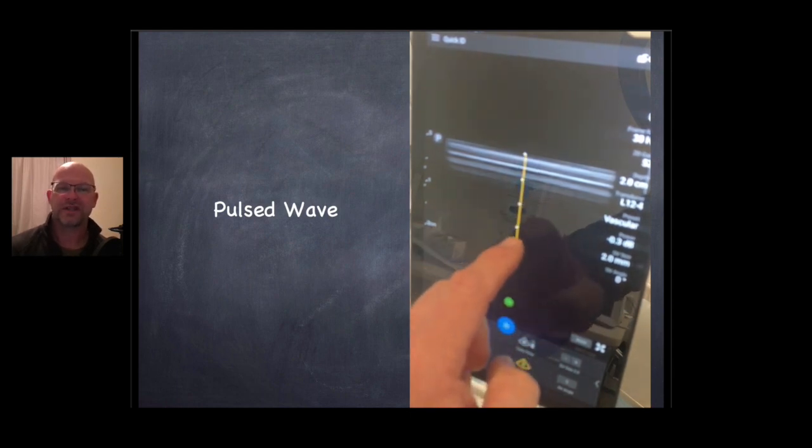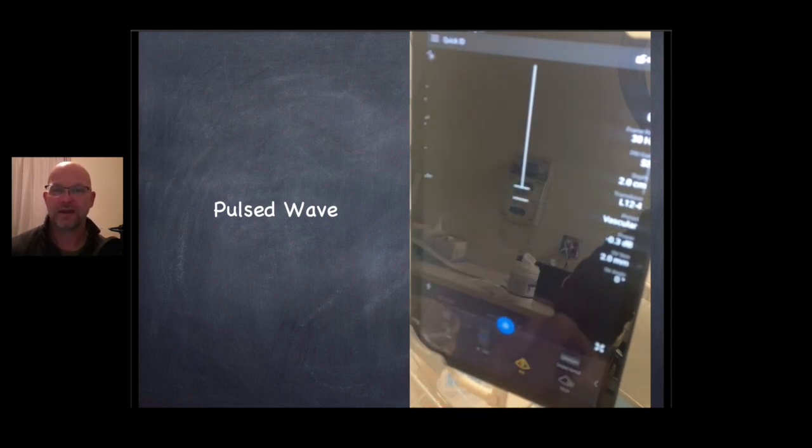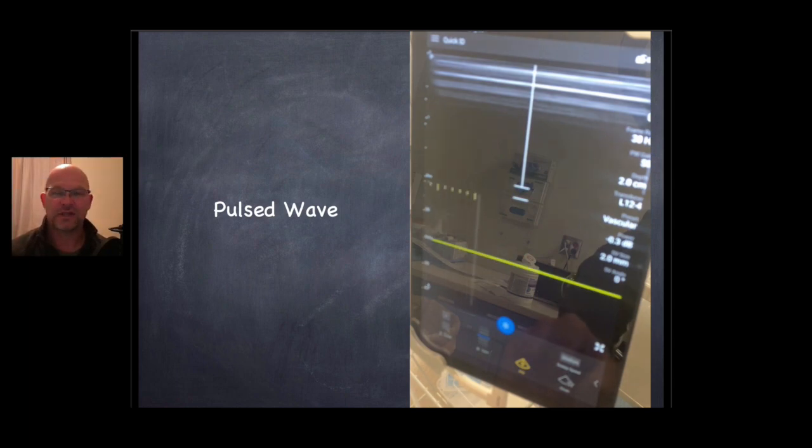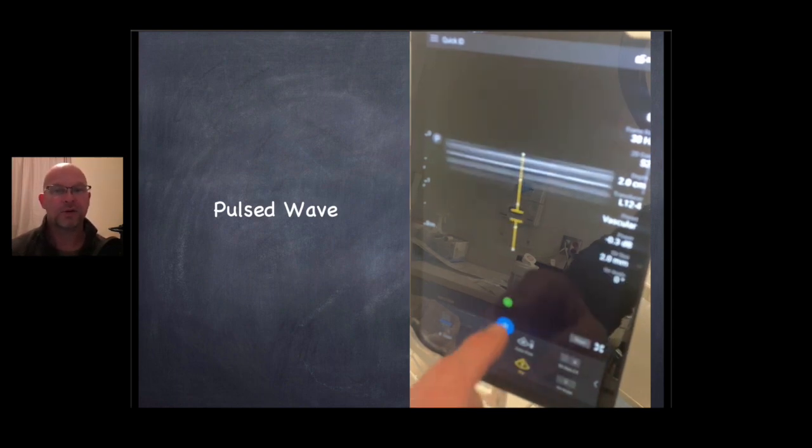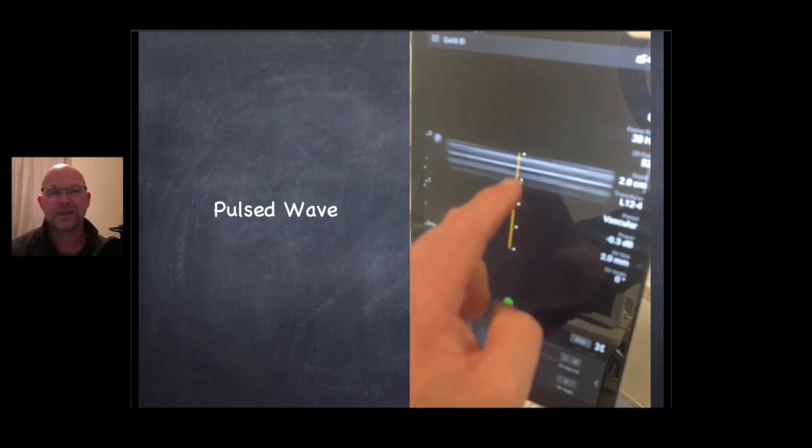Becoming proficient at this takes time. It's nerve wracking that first time. The patient does not need to know this is your first time trying that. As far as they know, this is your 1 millionth time doing this. But be comfortable and confident by practicing with this.